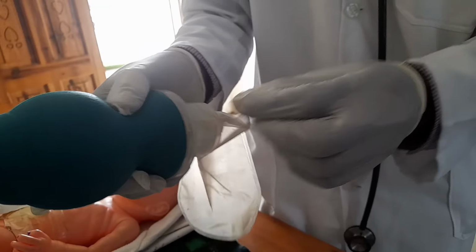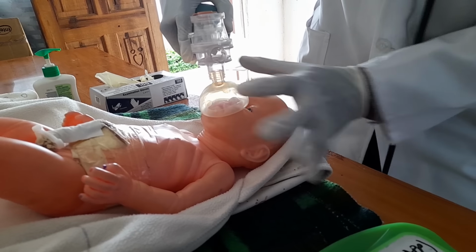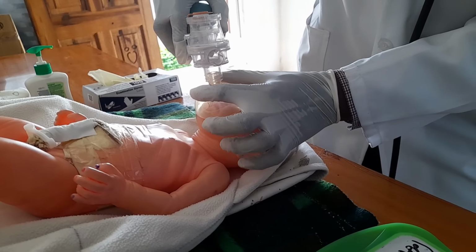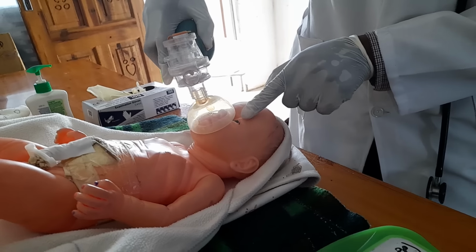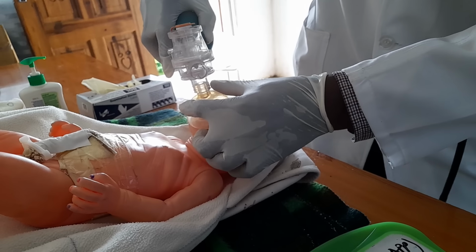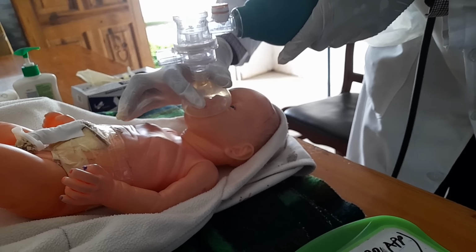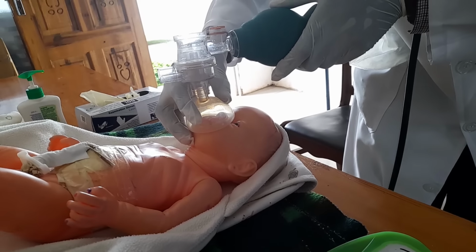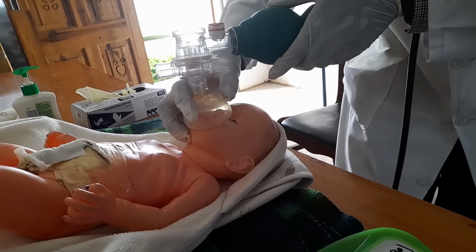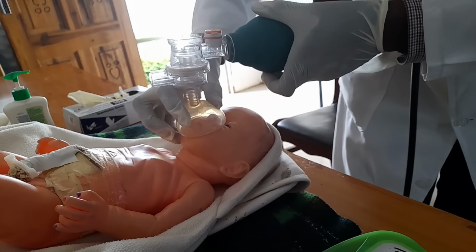So how you do it, you place it there, covering both the nose and the mouth, and then at least try to make a seal here, or you make a C, and then this C, meaning give consideration to the eyes of the baby. Don't compress the eyes of the baby. So make a seal and then connect there. So let me just interchange so that you see. Make a C there, then just do a little bit of a chin lift or a jaw thrust, just a little bit, so that you support the mask with this C here. Then you can give 5.